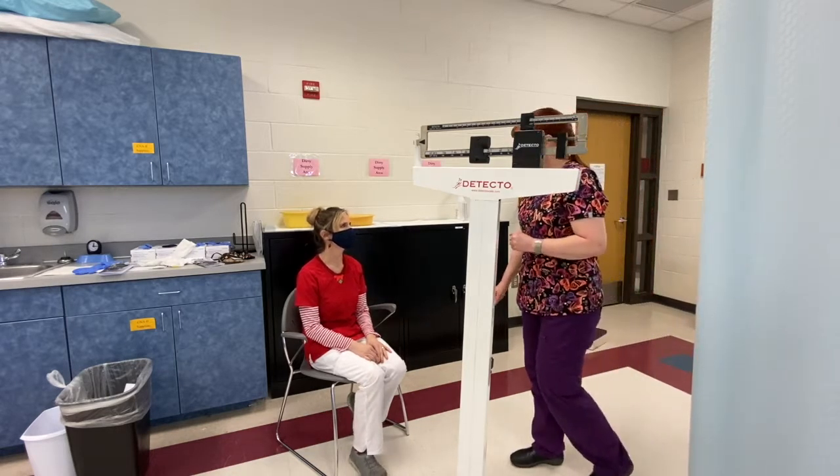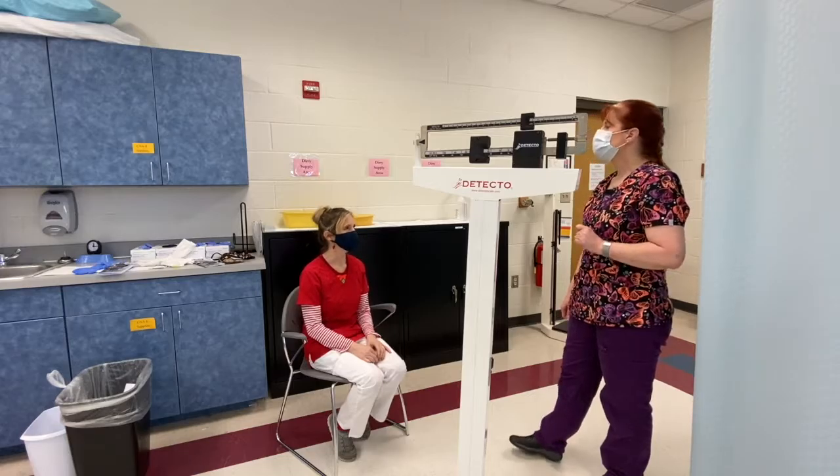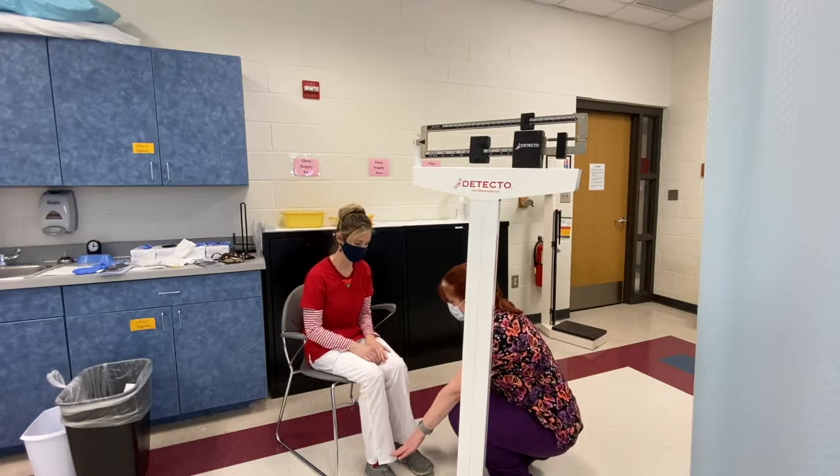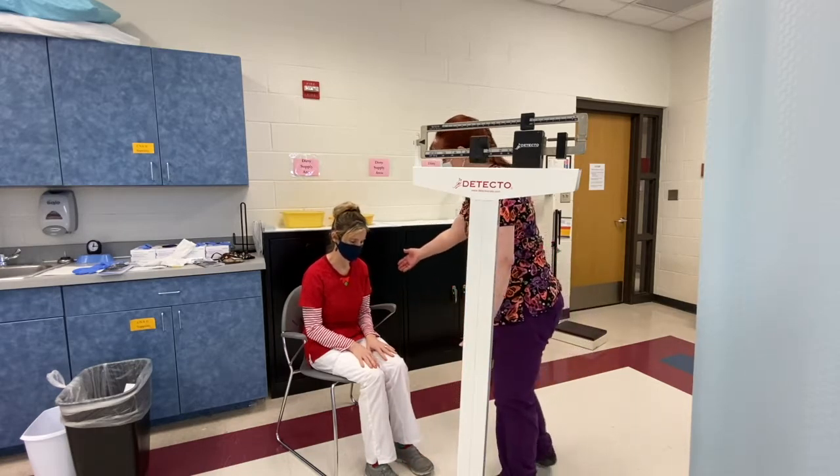Hi Mrs. Smith, my name is Patty. I'm here to get your weight today, is that okay? Yes. Excellent. I see you are sitting up right in the chair, and you have your non-skid shoes on. If you would please stand up for me.